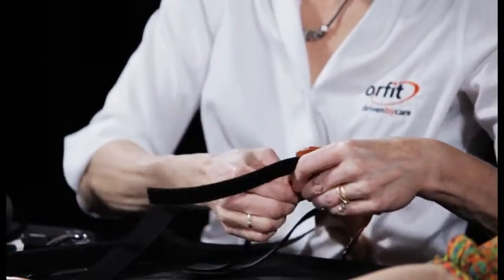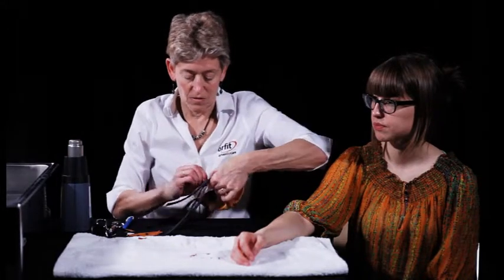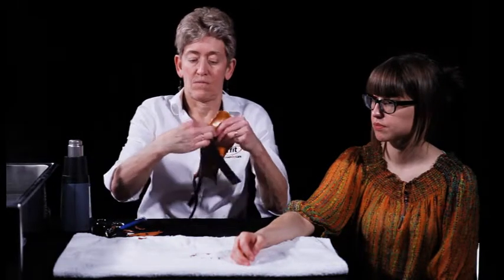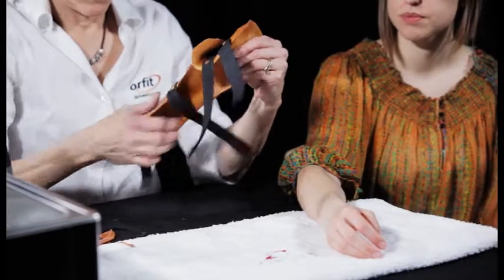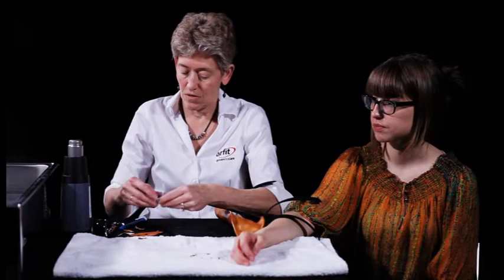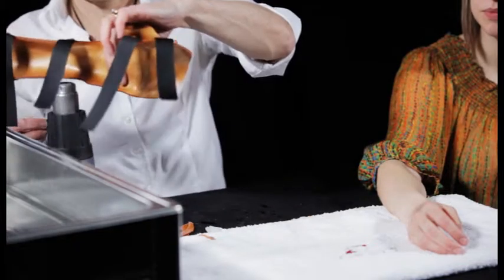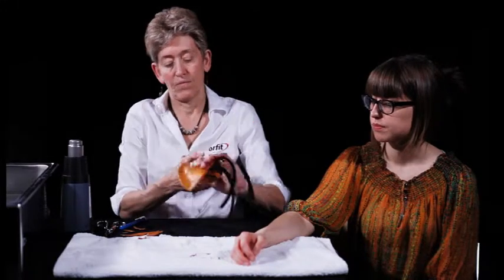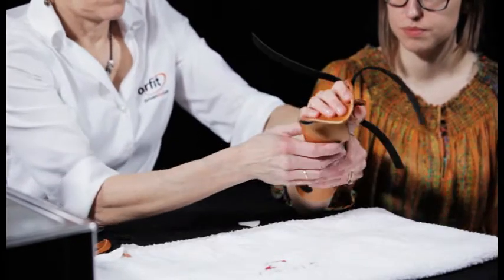Heat a small scrap of thermoplastic material with the heat gun until melted and press into the hole of the Velcro loop strap for a decorative button. Apply adhesive-backed Velcro hook on the opposite side of the orthosis. Make sure this hook stays in place by dry heating this adhesive and also by dry heating the thermoplastic material.